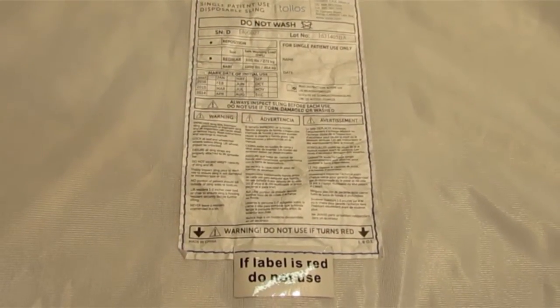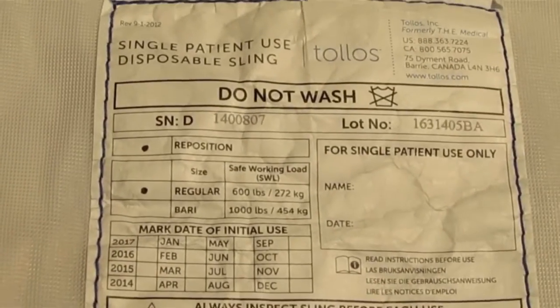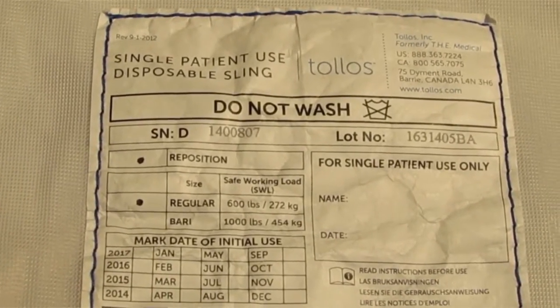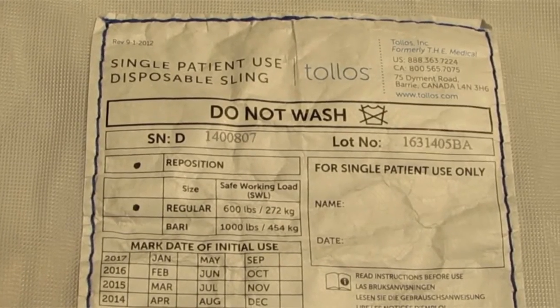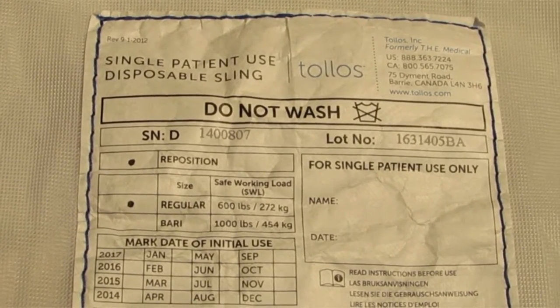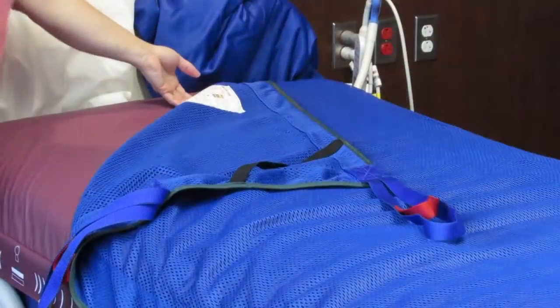It is available in regular, bariatric, and elite bariatric sizes, ranging from 600 to 1,000 pound capacities. The label clearly indicates the type, size, and safe working load of the sling.